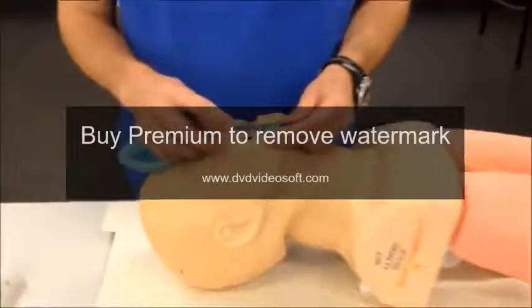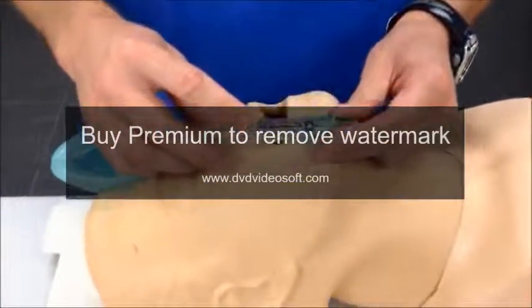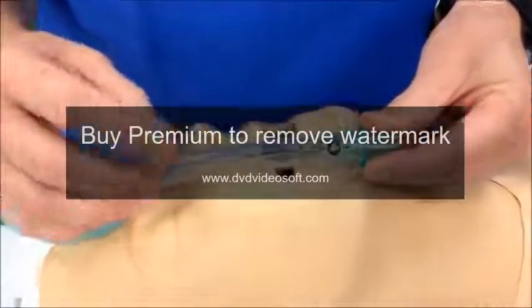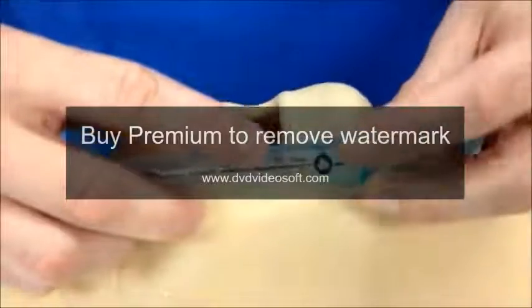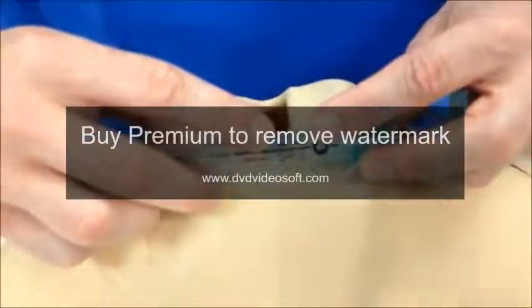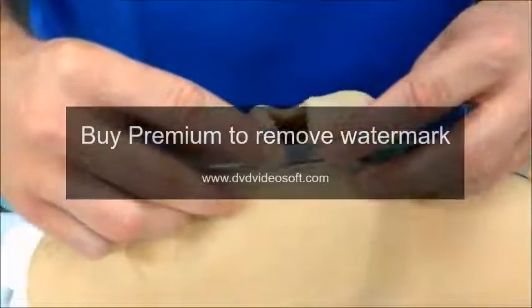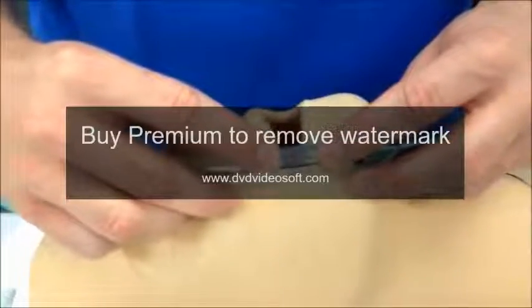Sizing of laryngeal mask airways are manufacturer specific, and the instructions will usually be printed on the tube itself. In this case, we can see that it would be appropriate for an adult weighing between 50 and 70 kilograms, and that the amount of air needed to inflate the LMA cuff is 30 milliliters of air.